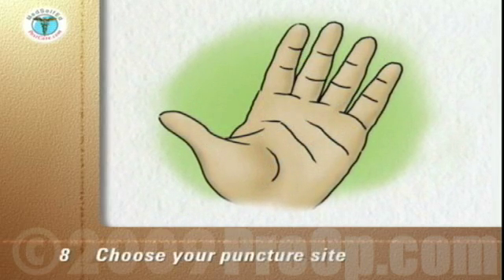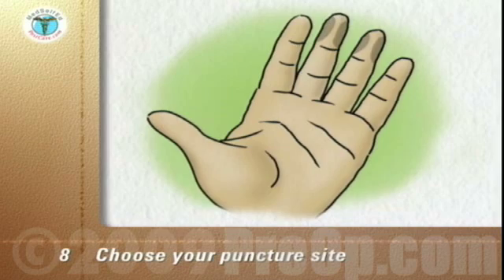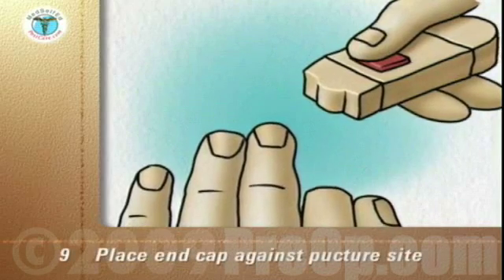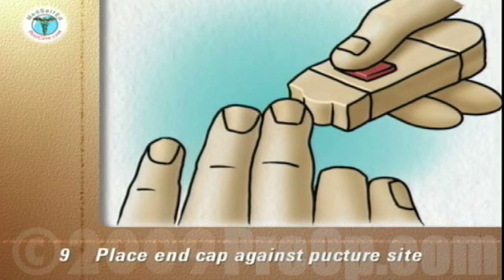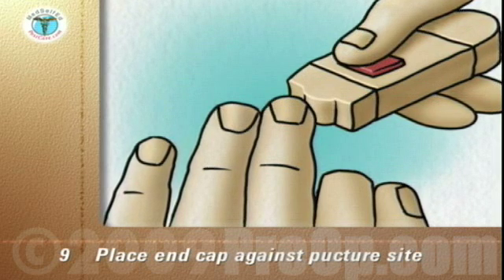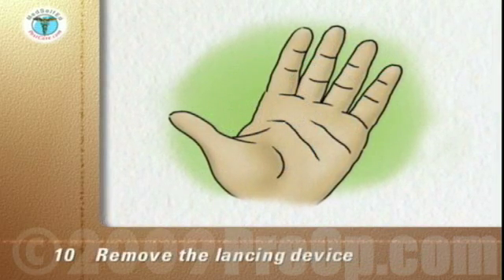Choose your puncture site. The sides of the end segment of the finger are the best sites. Stroke down the finger to push blood toward the puncture site. Place the end cap firmly against the chosen puncture site on the side of the fingertip. The more pressure you use, the deeper the puncture. Push the lancet release button without moving your finger or the device. After the puncture, remove the lancing device.